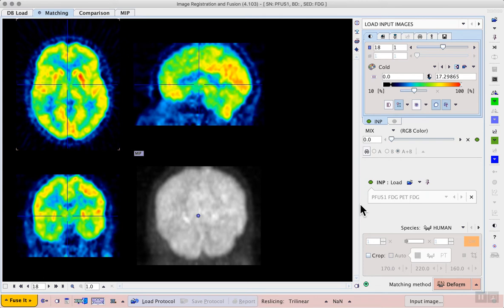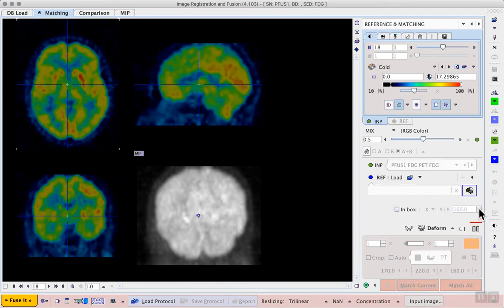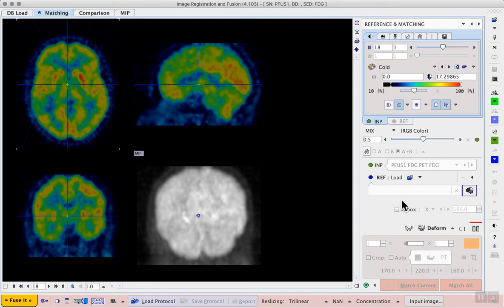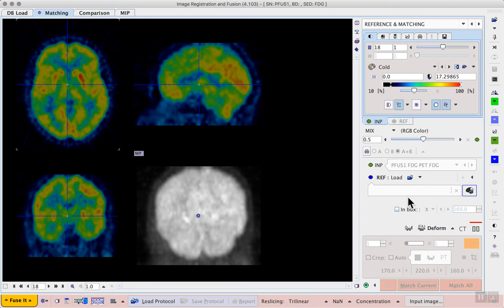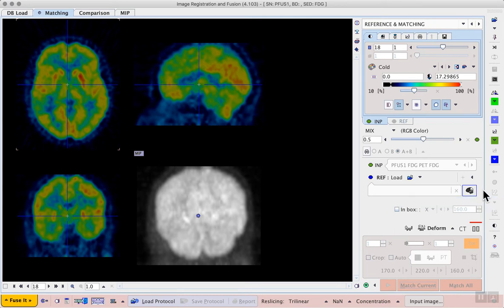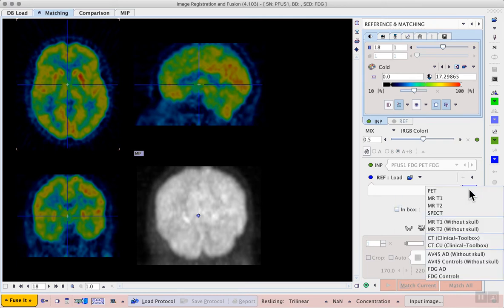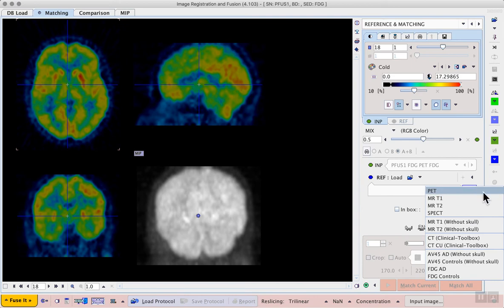Now we need to proceed to select our reference image so we proceed using the matching method deform workflow and this will take us to the next page in the series, the reference and matching page. Now on the right hand side we see the opportunity to load our reference data and for template matching we have a shortcut available. We don't need to load from database or any other method, we can use the blue labeled icon to the right of the reference loading area which shows us the list of available templates for the species that we're working with.